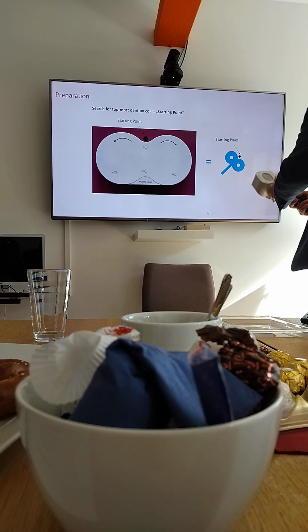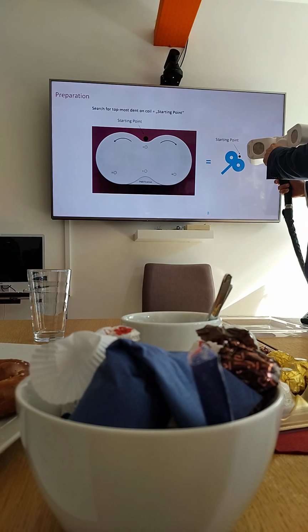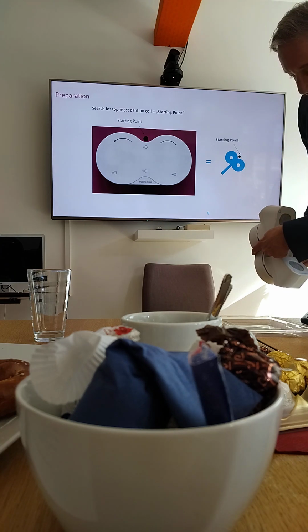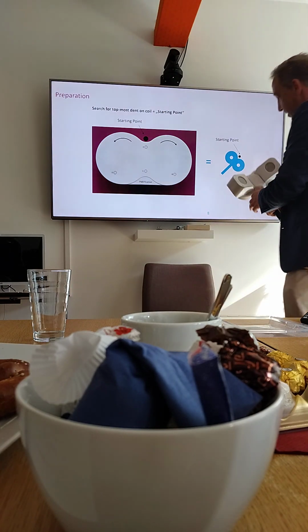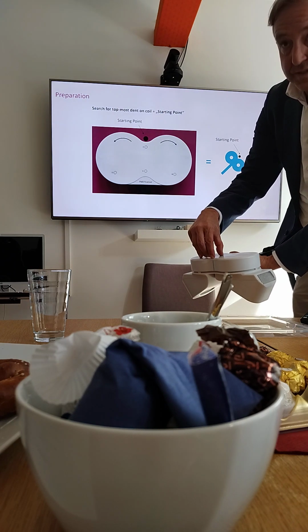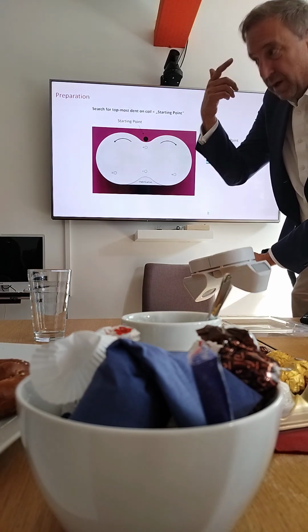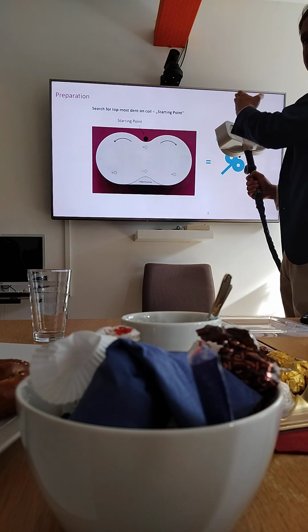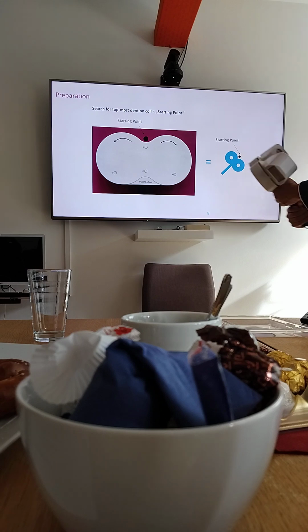Of course, when you look at the coil, you can't see this point. It's somewhere here, but you can't see it. Therefore, you have this line here, which is the starting point. From that line to the center, it is 5 centimeters. We will show you later, just for your information. So the point you're looking for is always 5 centimeters away from the actual point of the stimulation.